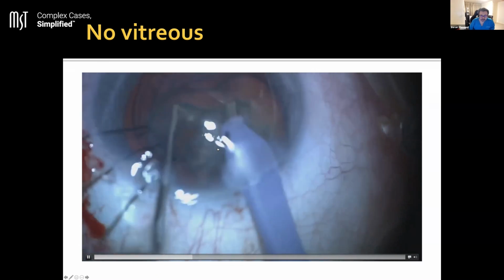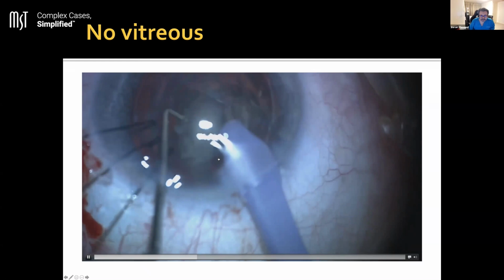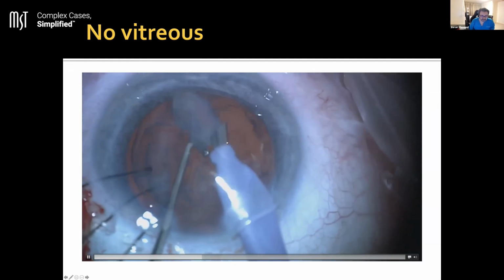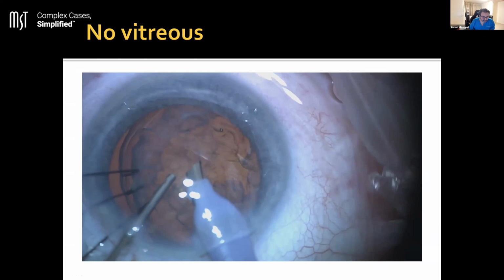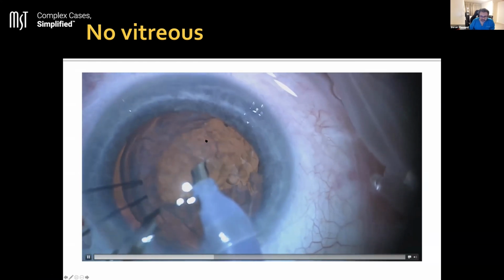Then I'm just going to move forward in the interest of time, and then you can get this lens out of the bag into the anterior chamber and phaco it relatively easily. At this point, you've got to be a little bit careful that the chamber doesn't collapse, so we go in with some viscoelastic just to pump up the anterior chamber, push the capsule back, and prevent vitreous prolapse when we come out with our phaco probe.